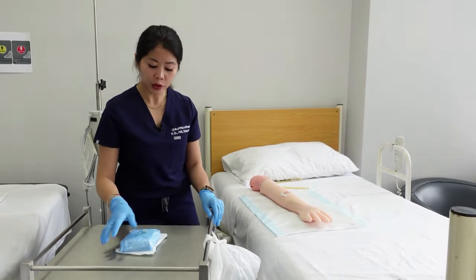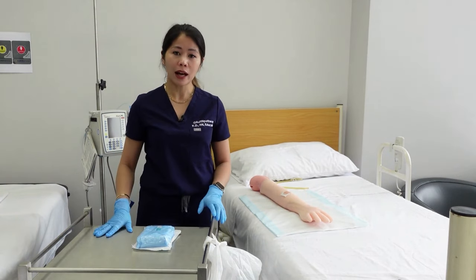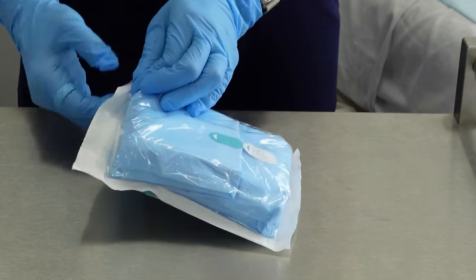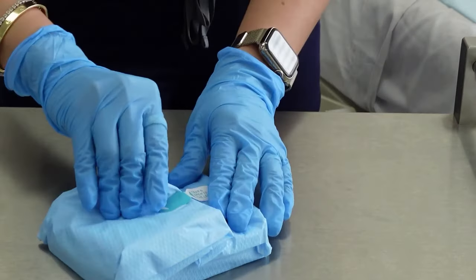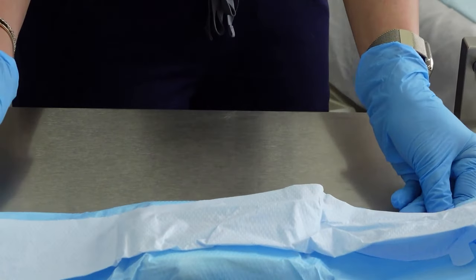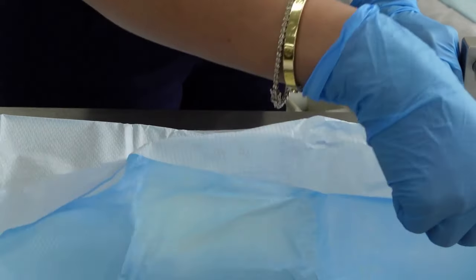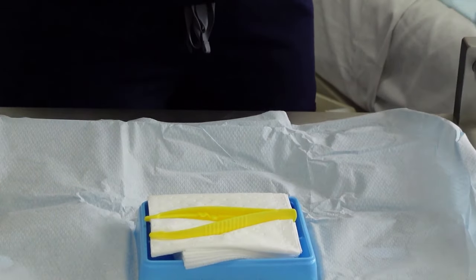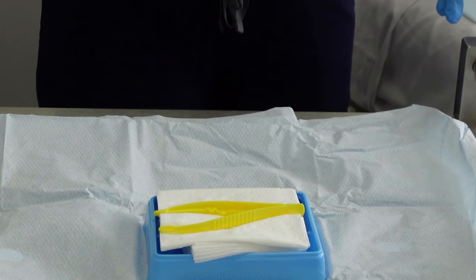Now it's time to open your dressing pack. This is the time that you really need to pay attention, as you can't be touching any part of the sterile field. When opening your dressing pack, always be careful not to touch the sterile field. Once you've opened it, one inch of the side is already considered unsterile.